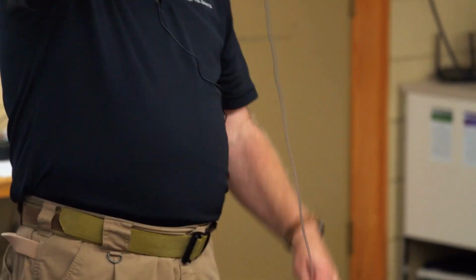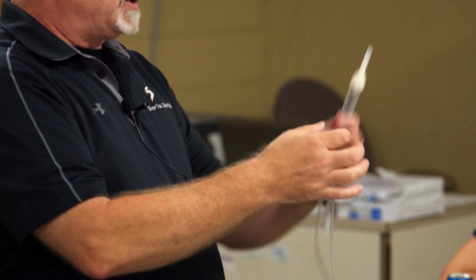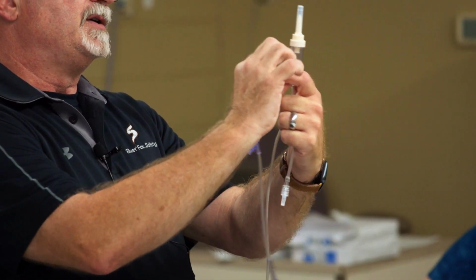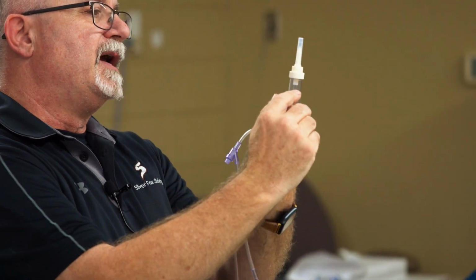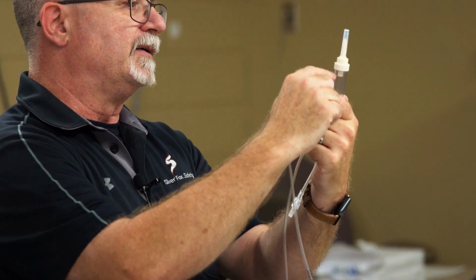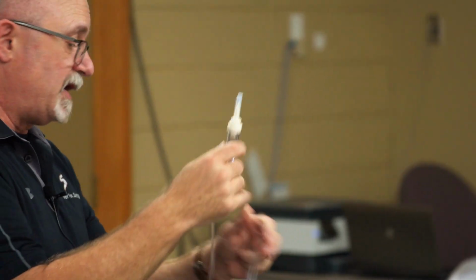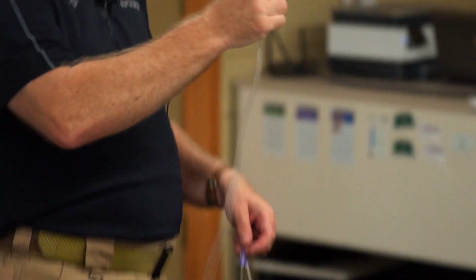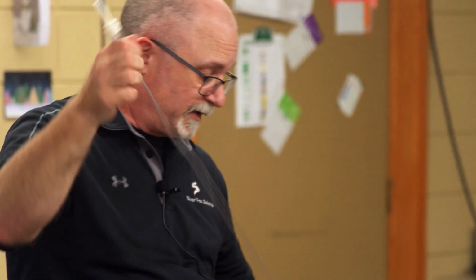Okay, so parts of the drip set. This is called your drip chamber up at the top. Fluid builds into here, so you can see that it's flowing. We don't want it to completely fill up, and I'll show you a couple techniques on that. And then as we're flowing, you'll see a drip come out of here. For a 10 drop set, 10 drips is 1 milliliter, so that's the volume. If we want to do rates, then we have to figure out how many drips per second to get whatever we want. So if we want to do 150 mils or whatever, we can do the math on that, and I'm not going to do it.